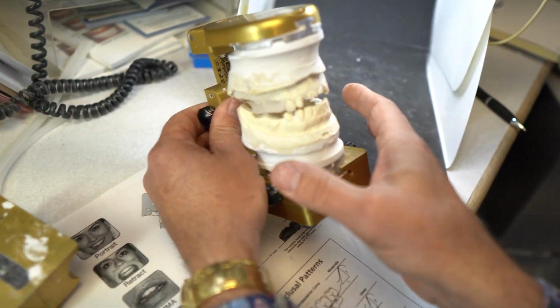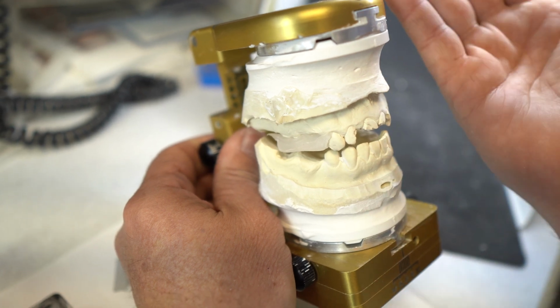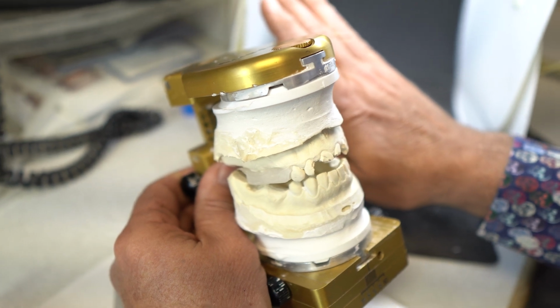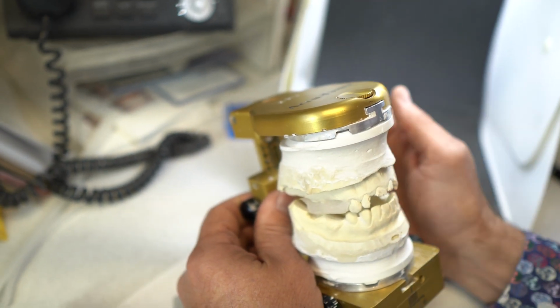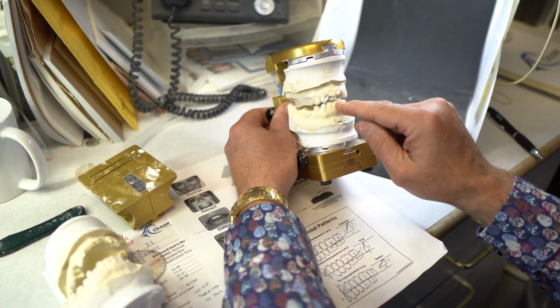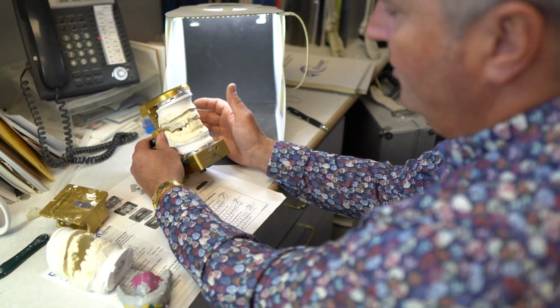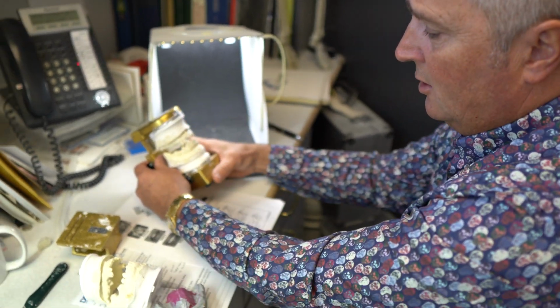Get the upper set up so it aesthetically looks good, and it's engineered to complement the angulation of the condylar fossa. Because we know for a fact, if a patient has a steep eminence of a condylar fossa, they can get away with an overbite, okay? Because they open and close like a rabbit. But if that patient has a flat eminence and you have designed the incorrect occlusion, you're going to break teeth, you're going to displace dentures, and you're going to create problems for implants down the road. You have to match the occlusion to complement the condylar eminence.